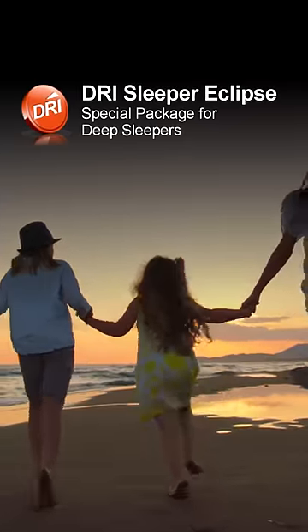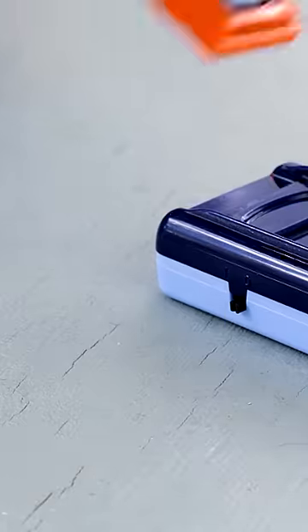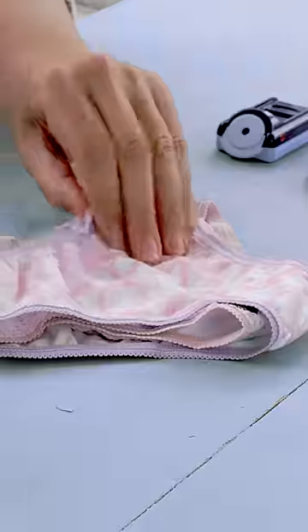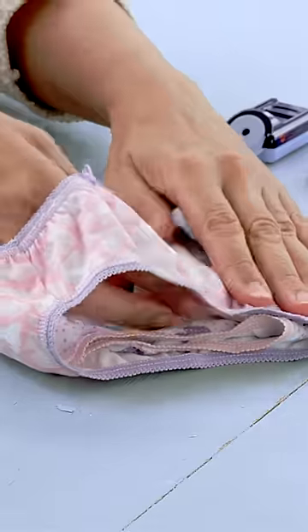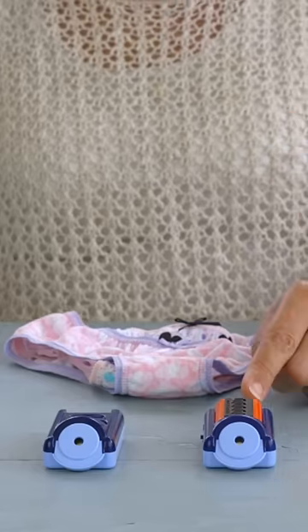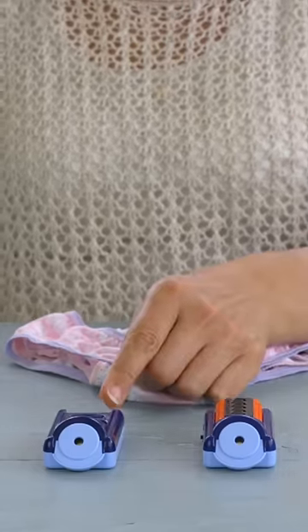The DrySleeper Eclipse is a wireless bed wetting alarm for children. The small plastic sensor inserts into a diaper, sanitary pad or underwear, and the alarm is placed just out of reach. The Eclipse special package comes with an alarm for the child's room and an alarm for the parent's room, so they can quickly respond and gently wake their deep sleeping child.